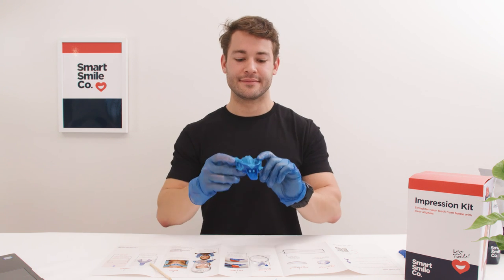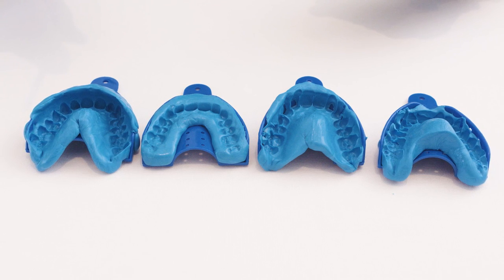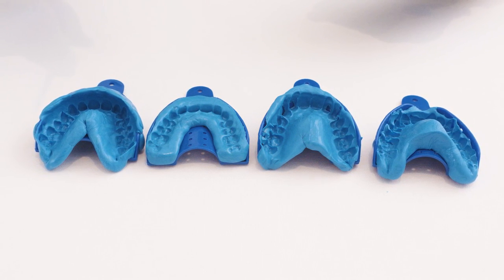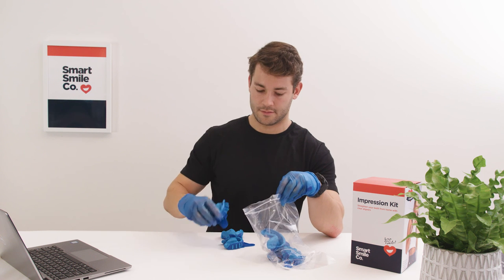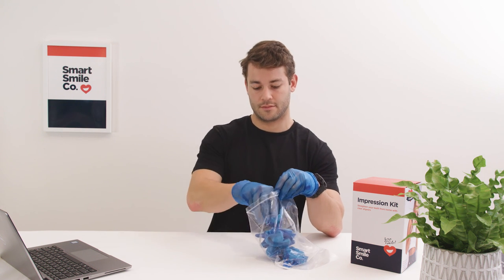Compare the impression to the examples in your guide to identify any issues so you can improve for your next impression. It is recommended that after taking your initial impression, you send some pictures to get feedback before taking the remaining sets. However, if you feel confident, you can proceed. No matter how you judge your impressions, place them all in the resealable bag to return to us.